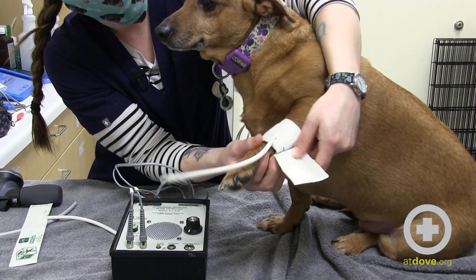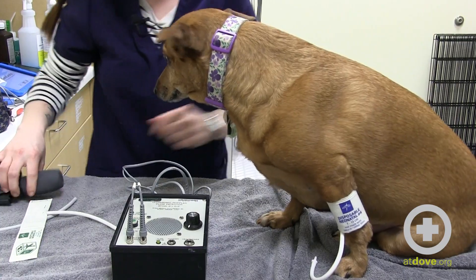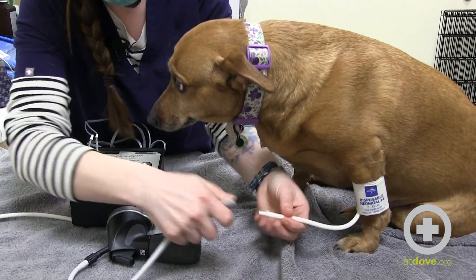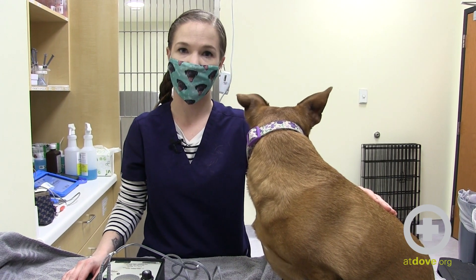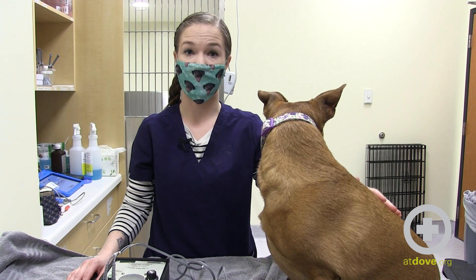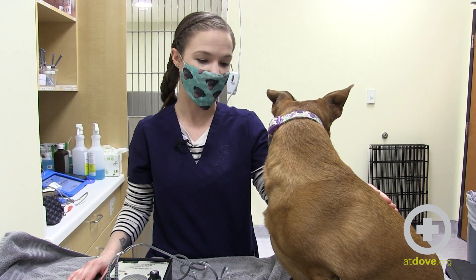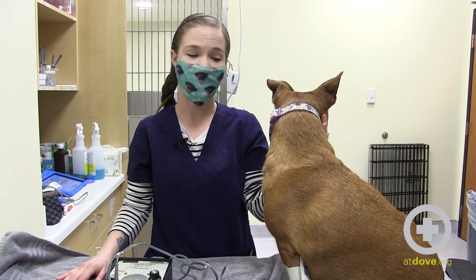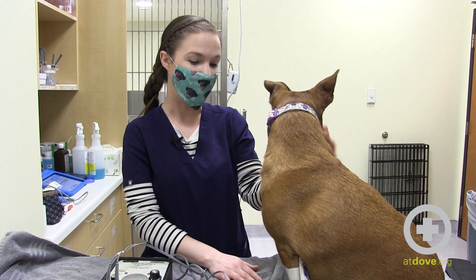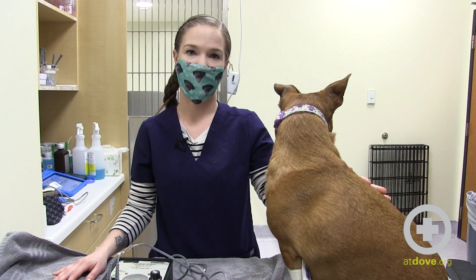We will attach our spig. So we've fitted Penny with her cuff. Positioning is something that's also very important. The ideal position is lateral. For smaller dogs, you can usually get them in lateral by yourself, but for larger animals you'll definitely want to use two people. That's going to give us the best, most accurate reading. We want that limb to be at the level of the heart. Because Penny is a little nervous when she goes into lateral, we're just going to demonstrate this with her sitting. If you have a dog that seems really nervous, sitting or standing is probably the safest thing to do.